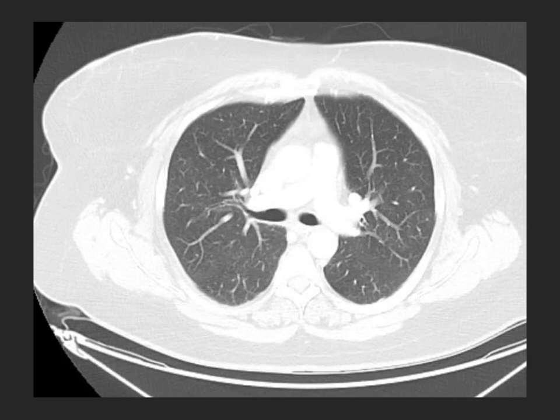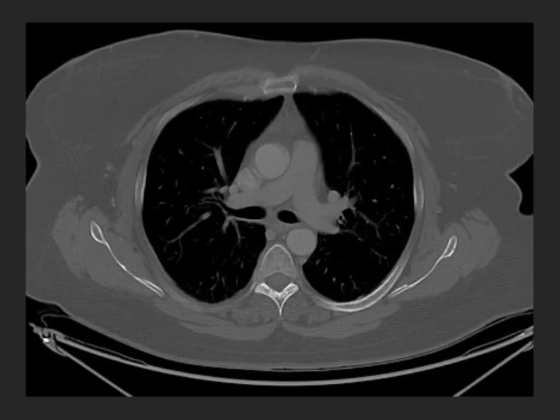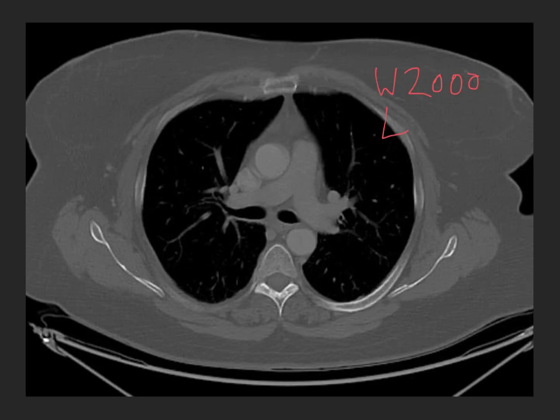Here are commonly used window and level settings: a lung window uses W=1500 and L=minus 700; a soft tissue window for the mediastinum or abdomen uses W=400 and L=plus 40; and a typical bone window uses W=2000 and L=plus 300. These values vary quite dramatically depending on what tissues we want to look at, and we concentrate the 256 shades of gray into the expected density range of the tissues of interest.